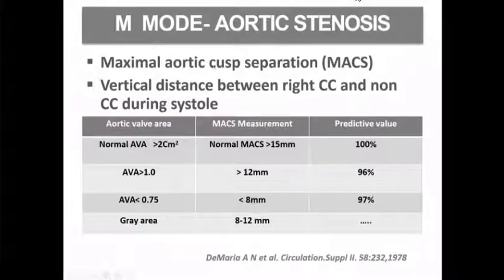So in the last, because the MOD we are not much considering, there is now only this separation of the maximal aortic cusp separation.